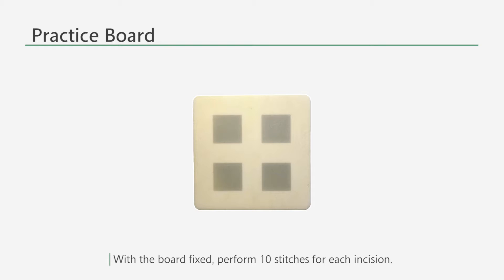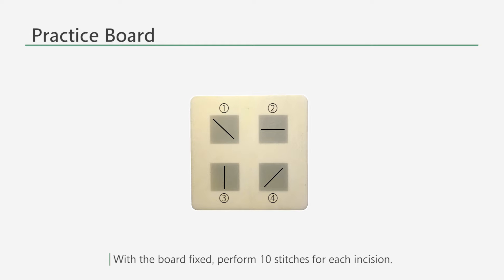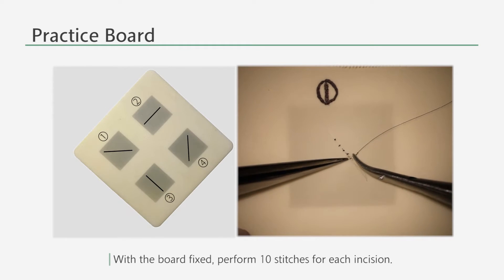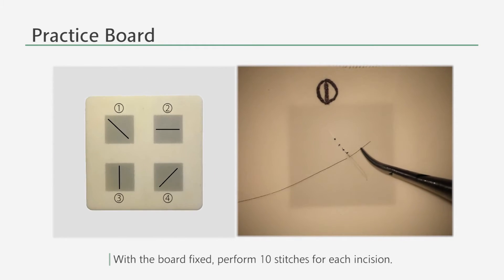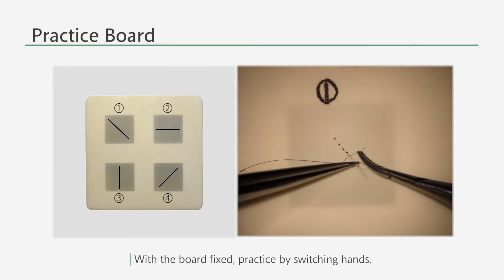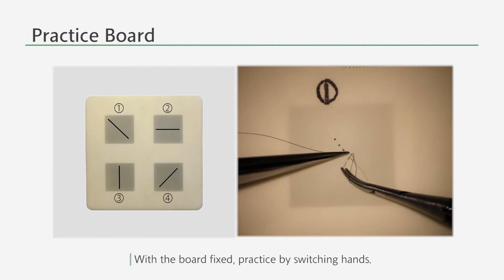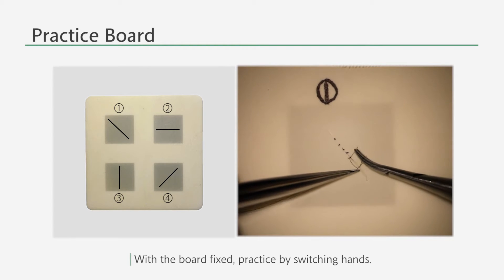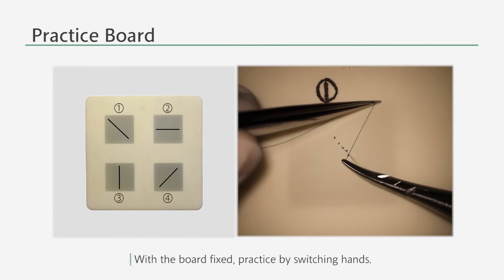The first training is with a practice board. In this training you have to place a practice board at its designated place, make incisions as shown in the picture, and perform 10 stitches for each incision under the microscope in the ascending number. Since rotating the board in your desired direction defeats the purpose of this training, you must switch hands instead of doing so.